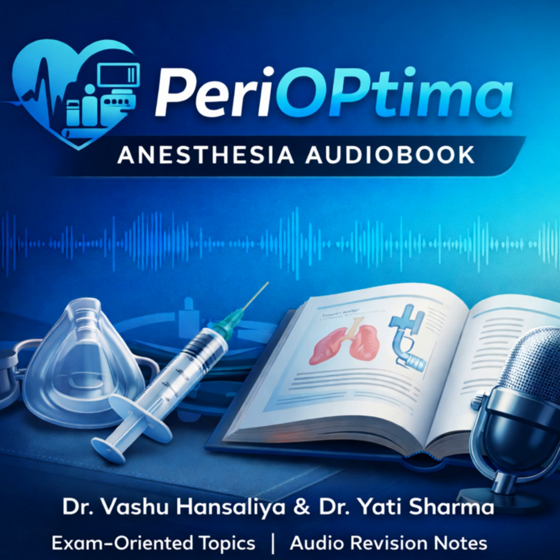Gold standard. Absolutely. Capnography confirms the presence of end-tidal CO2, verifying that the device is correctly positioned in the airway and that effective gas exchange is happening. Our sources highlight its necessity, especially in high-stakes scenarios like CPR.